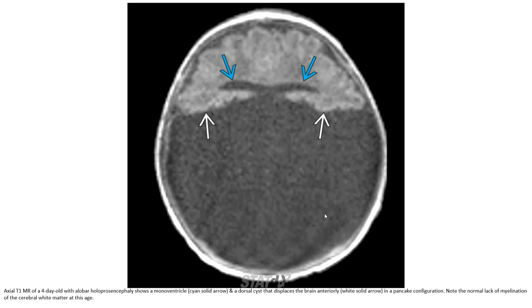So let's see this in this case. This is the axial T1 image of a neonate with alobar holoprosencephaly — showing a monoventricle and a dorsal cyst that displaces the brain anteriorly in a pancake configuration. Note the normal lack of myelination of the cerebral white matter in this neonate.